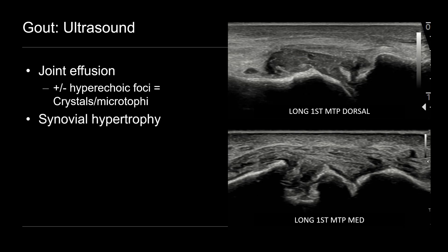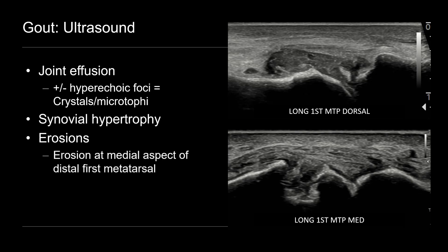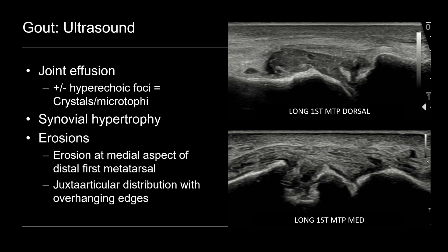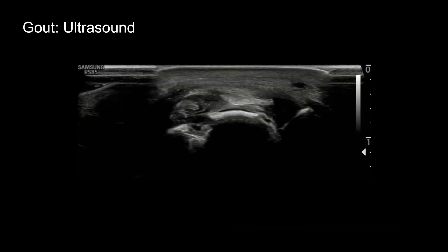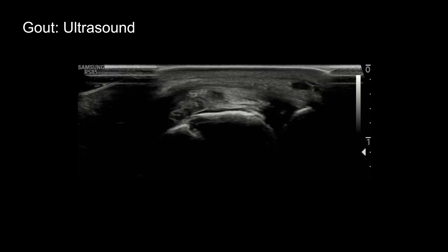Synovial hypertrophy is common, as are erosions — typically at the medial aspect of the distal first metatarsal. The classic appearance of erosions is that they are juxta-articular in distribution, meaning they're adjacent to the joint but not directly at it. They have overhanging edges, sometimes described as having a punched out appearance. We can often appreciate this best in real-time evaluations.